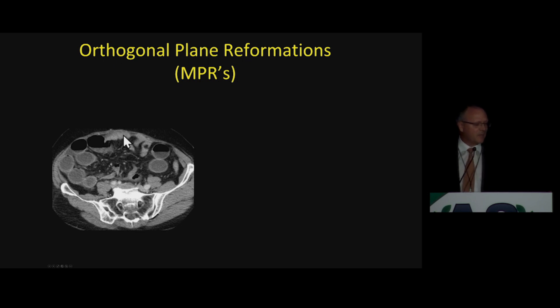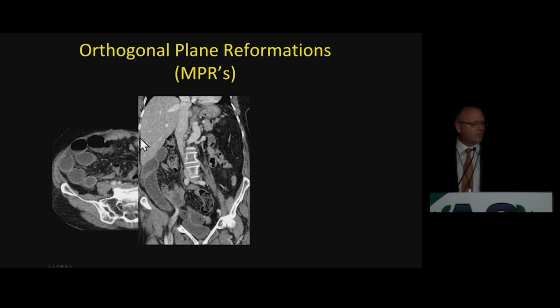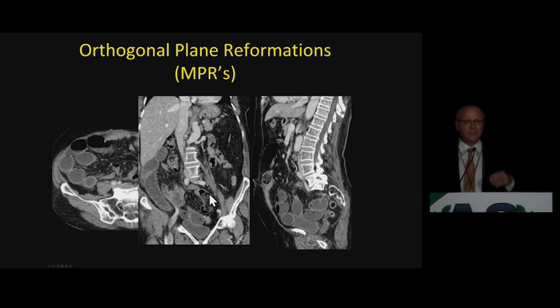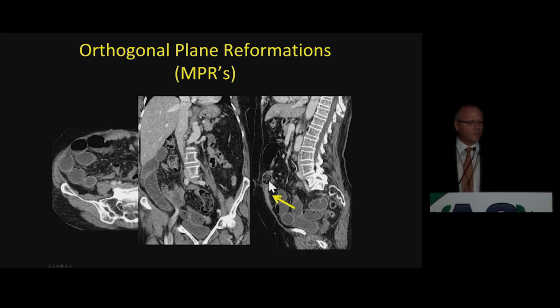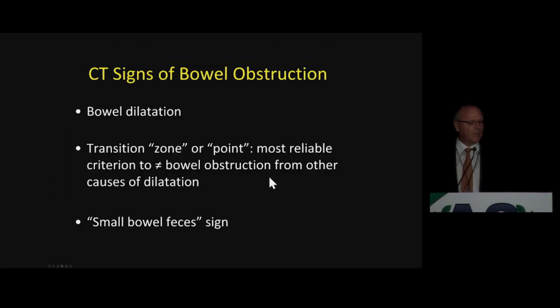For example, this case — there's dilatation of small bowel, there are some collapsed loops, so already we're thinking there is bowel obstruction. We scroll up and down and don't see the transition point. The same with the coronals — we now see the small bowel feces sign. Yes, there's obstruction, but instead of spending a lot of time in the coronals and the axials, very quickly in the sagittal view, we see exactly where the obstruction is. That's the transition point with the small bowel feces sign. So we use the three planes routinely and interchangeably to determine what is important in bowel obstruction.